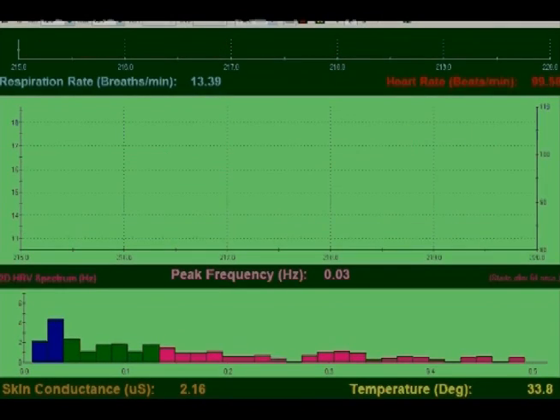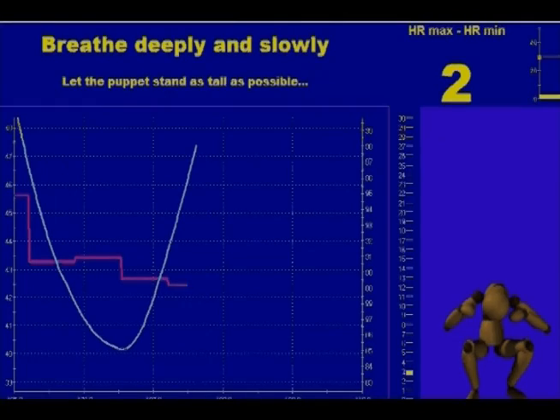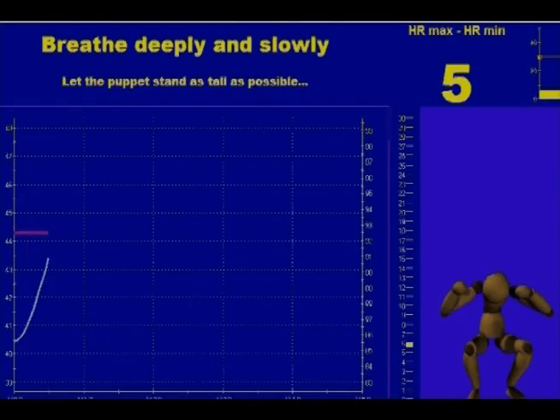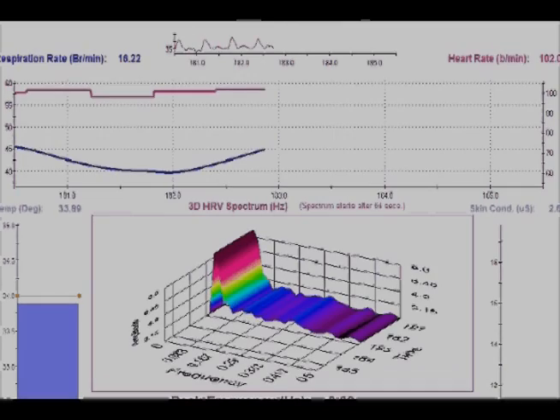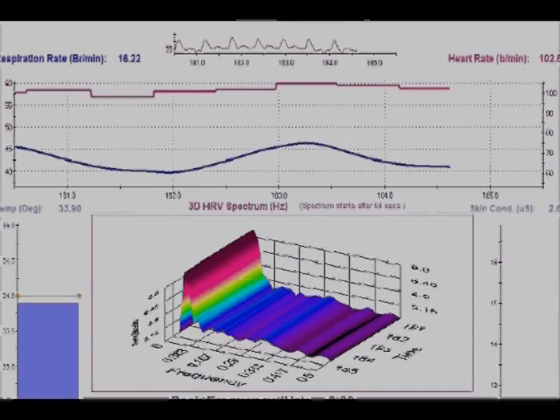Biograph Infinity excels at monitoring and providing heart rate variability feedback. You can view spectral information on very low frequency, low frequency, and high frequency, as well as heart rate and respiration.